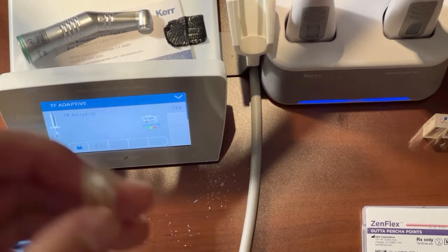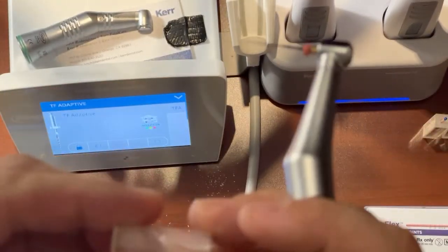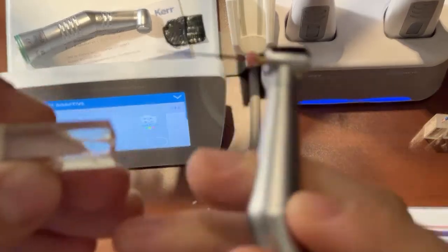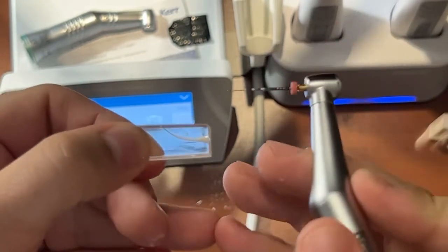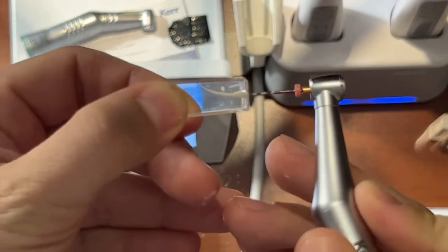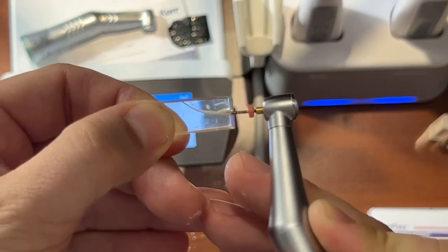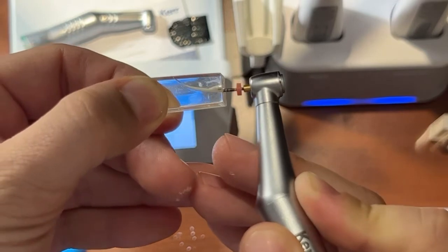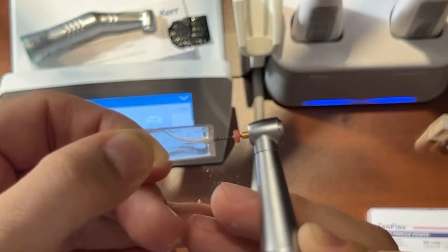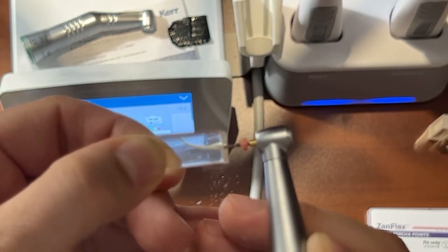So now I'm going to take our little root canal here that we shaped a little bit earlier, and I'm going to start creating my glide path. I'm going to start shaping with my glide path file. And what you'll see in here is that reciprocation is starting to begin. So now you can kind of see what that looks like.